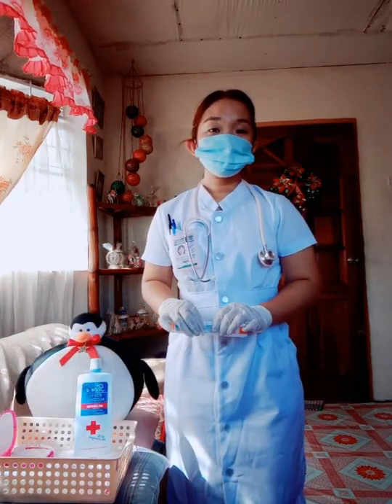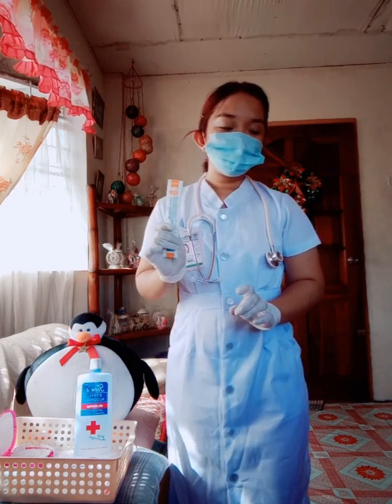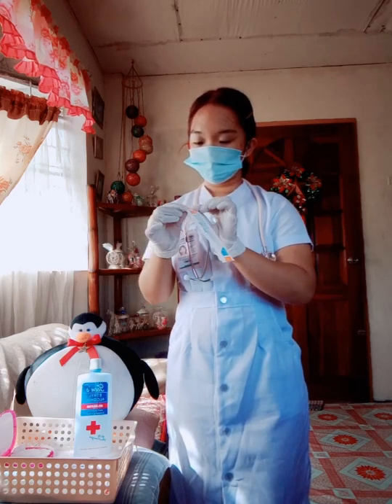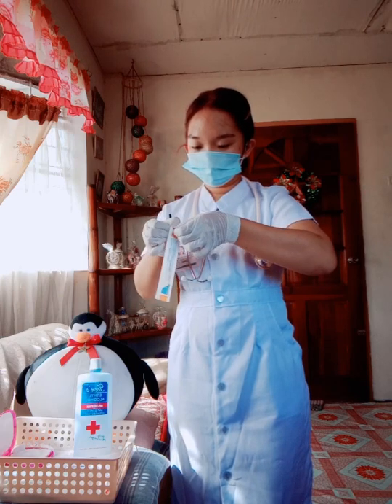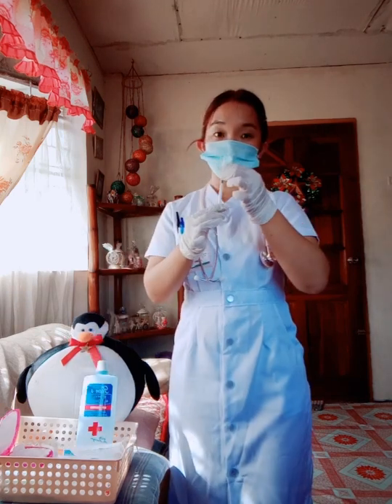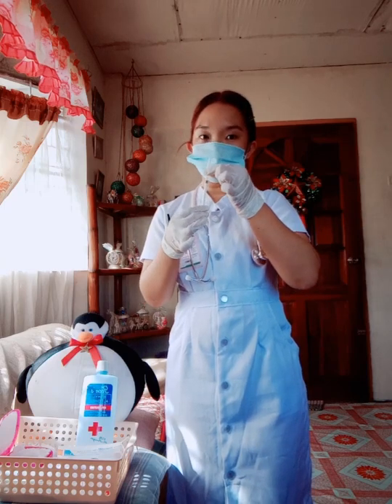The seventh step for the procedure is to prepare the syringe for injection. So I have a syringe here. Open here. Now open the syringe. Remove the needle cover without contaminating the needle.